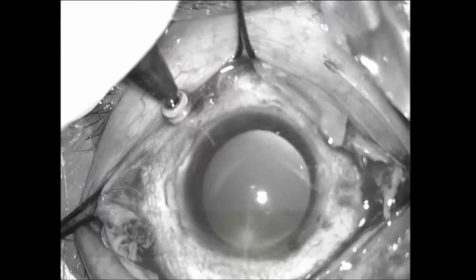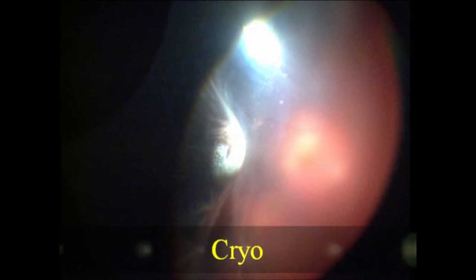External sutures are taken and at this stage a good buckle effect with flat retina is appreciated. In another case with a myopic RD, a similar approach is carried out. The breaks are identified and cryopexy is done.